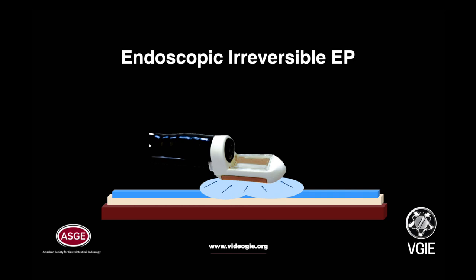The electroporation device is placed directly onto the tumor. A vacuum feature assists in drawing the tumor tissue into direct contact with the electrodes. The electrical pulse is delivered from the lateral walls of the chamber from side to side. The ablative area is non-thermal. The minimum ablation volume is 1.5 centimeters cubed.